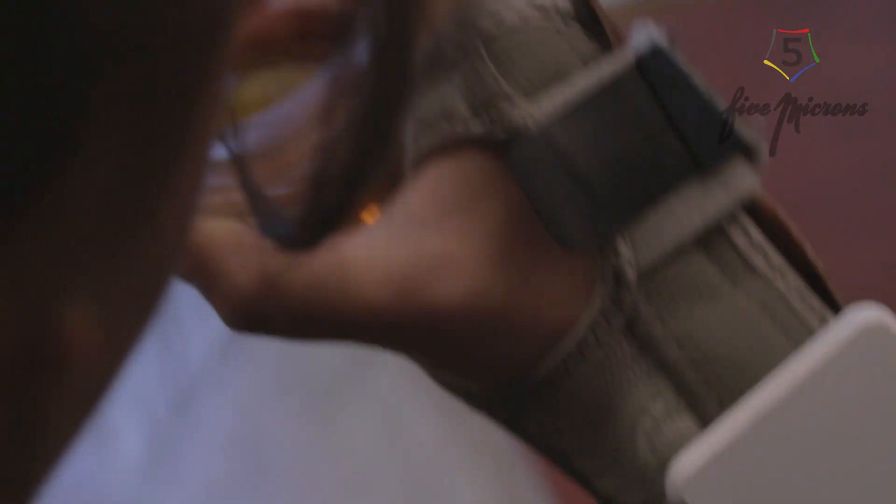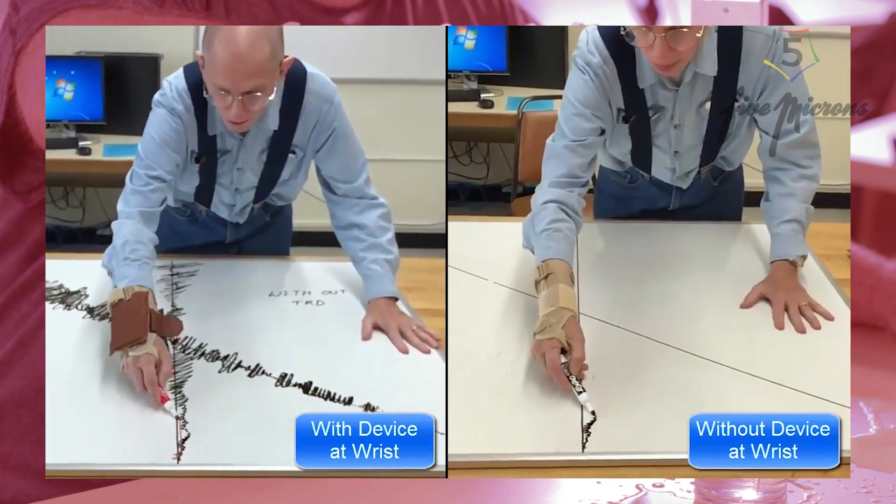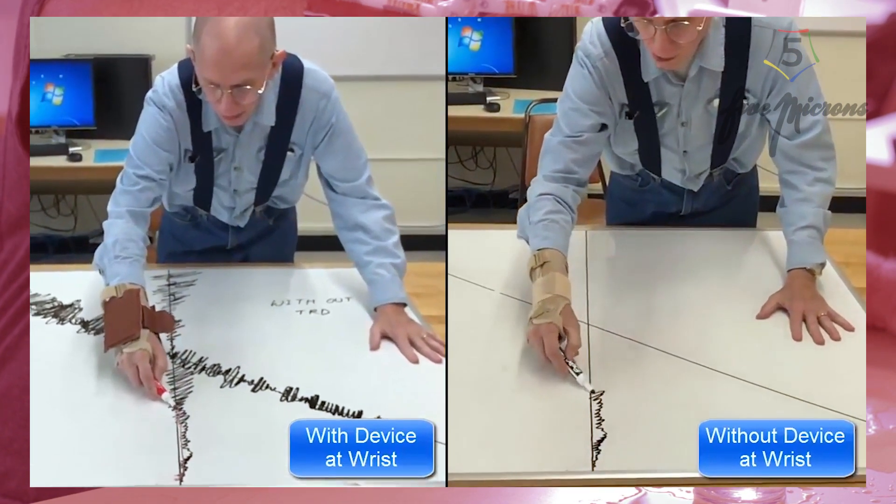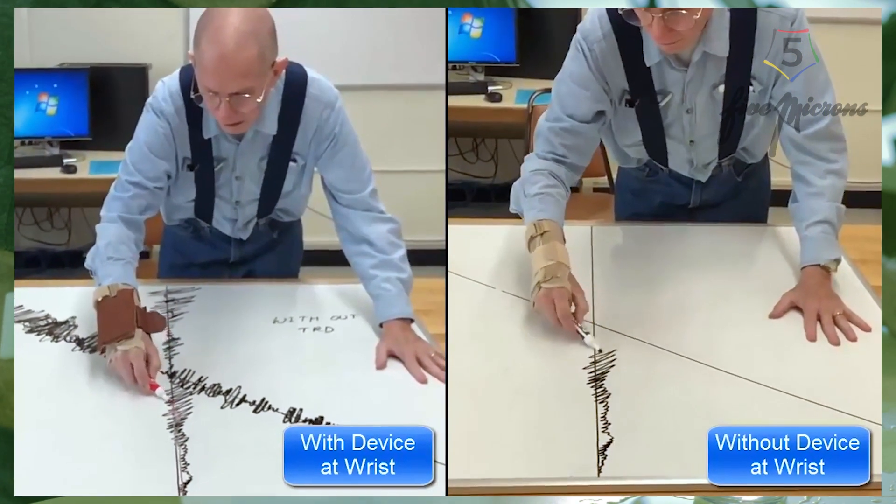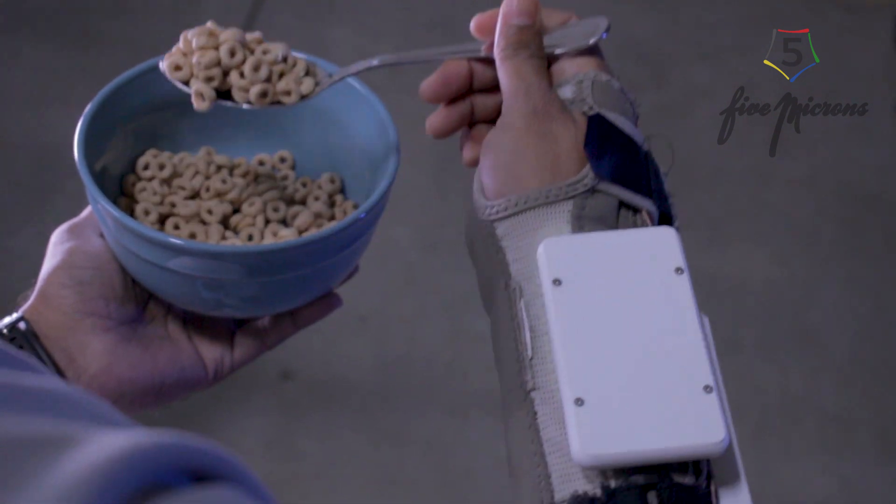Fresno State professor has developed an invention that could be life-changing to patients dealing with hand tremors. He explains how the anti-tremor device works. 5 Microns launched with humble beginnings, sparked by a simple mission to help others.